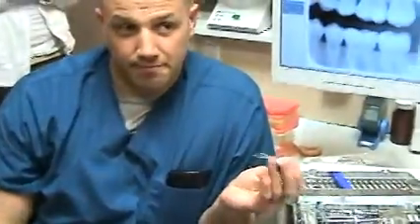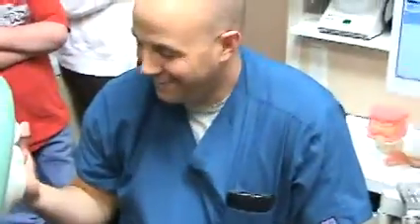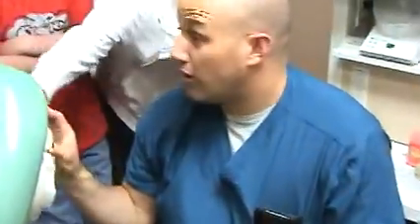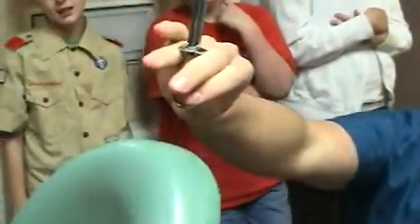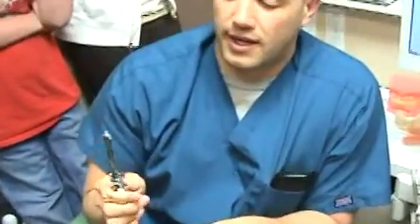Okay. All right. So, what do you guys think this is? Clamps. What do you think I use that for? To hurt kids. This is a syringe. So what do I do with that? Okay, I load a needle onto this end. And then I can load a carpule of anesthetic into there.